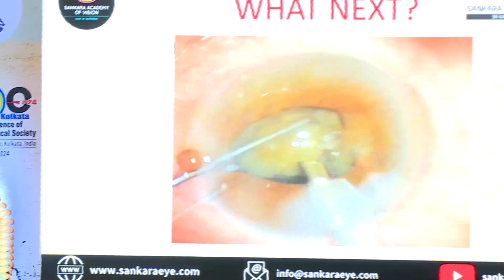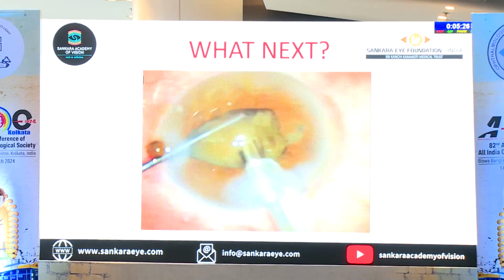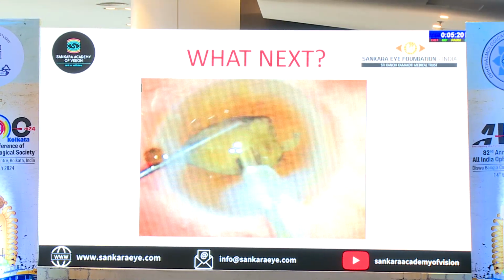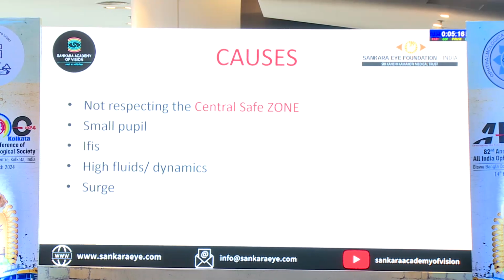Now once you touch, you're done. The iris is always going to come to you all the time, and sometimes you feel like just cutting off the iris and going ahead with the surgery, especially if it is subincisional. So what are the causes?